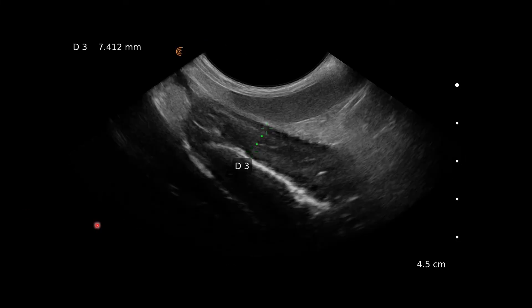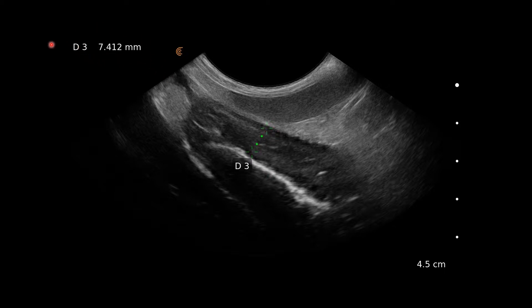Here we're looking at the stomach. This is the stomach wall; this is the gas in the lumen, and the stomach wall is very thickened. We'd normally expect that to be closer to three millimetres, and here we've got it at seven millimetres.